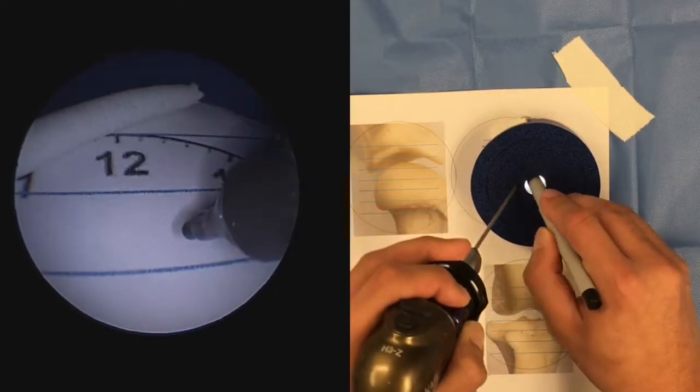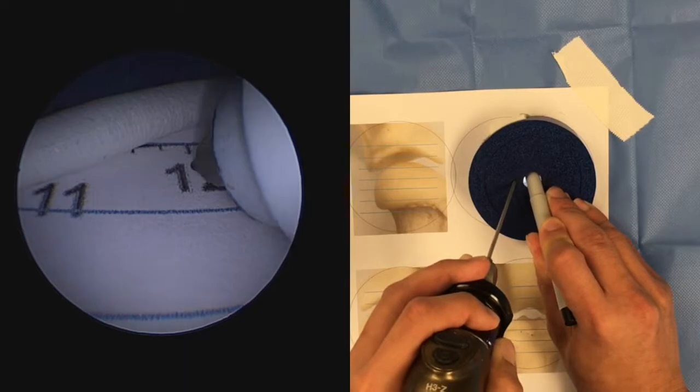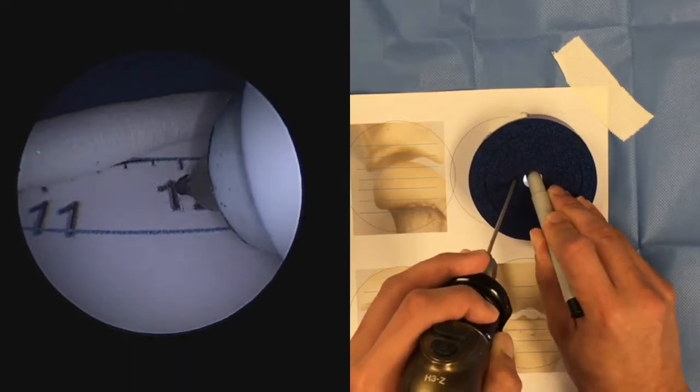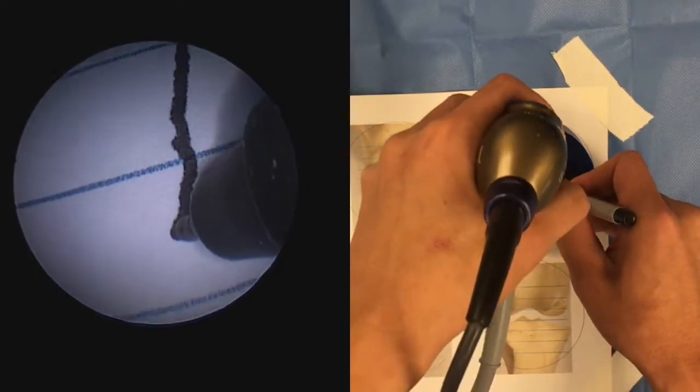In this case I've got the pen, the sharpie, in the right hand, so we're going to triangulate here and find the tip in the field of view. Starting at twelve o'clock, we're going to move down to the seven o'clock position.